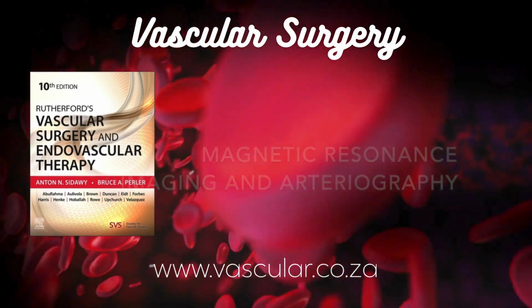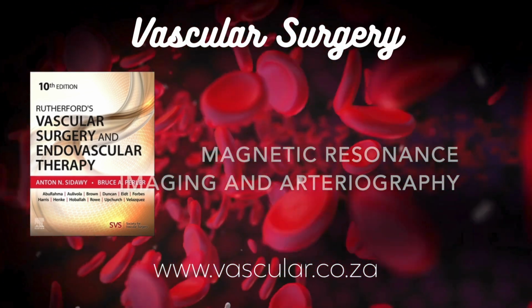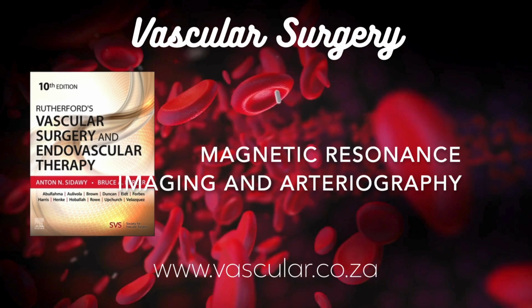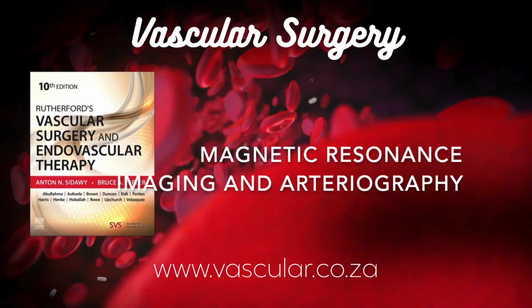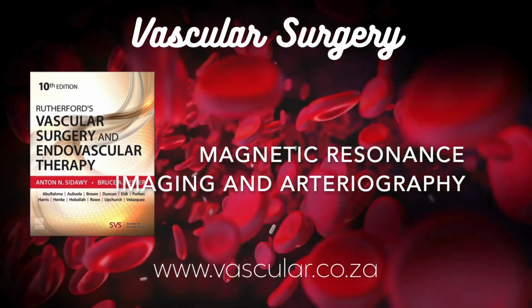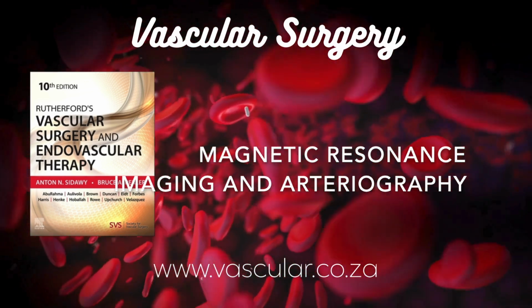Makes sense. Now, down to the limbs, peripheral vascular disease, or PVD. Yeah, MRA has really become a standard non-invasive workup tool for PVD. It's excellent for preoperative assessment. How so? It shows the inflow vessels, identifies where the blockages or narrowings are located. Compared to the old gold standard, catheter angiography, DSA, MRA stacks up really well, high sensitivity and specificity for significant disease. Any advantages over DSA?